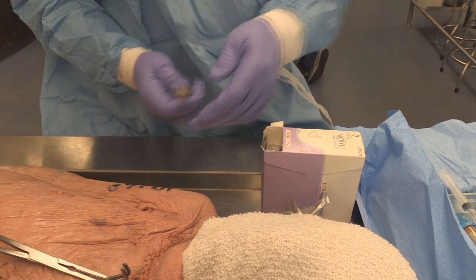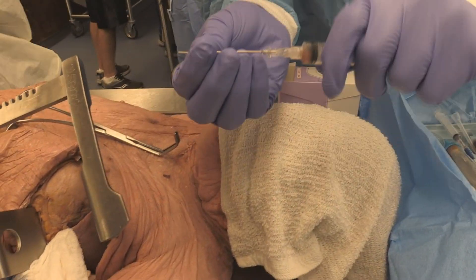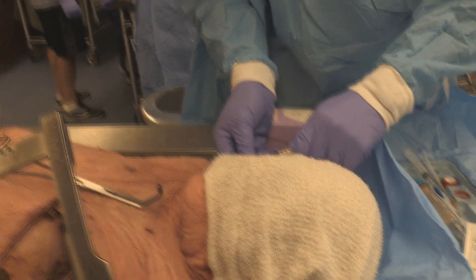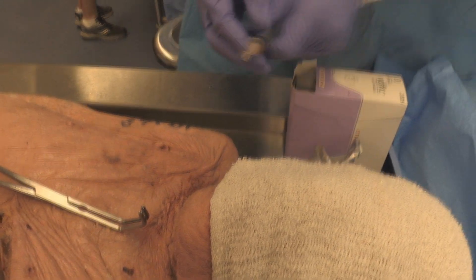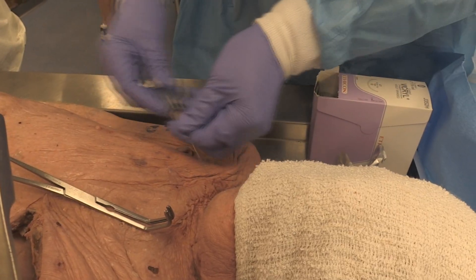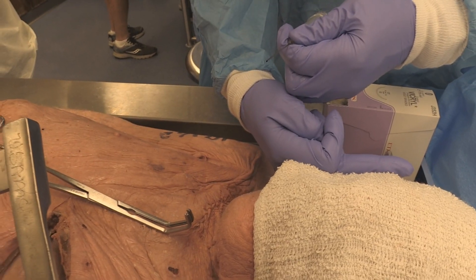That's particularly important when you're doing internal jugulars. If you're doing a left internal jugular, you want your bevel pushed over this way so when the guide wire comes out it goes that way. If you're doing a right internal jugular, you want the bevel straight up so it goes straight down. When you're doing it this way and I turn like that, you want your bevel to be turned downward — because if you do it with the bevel up, when you put the guide wire in, it'll go up into the head.